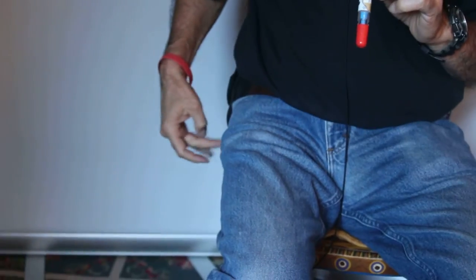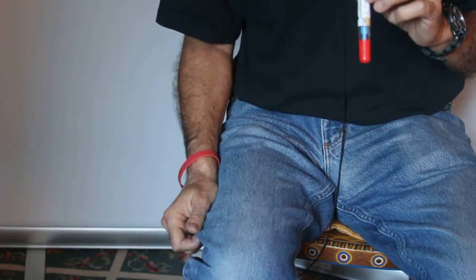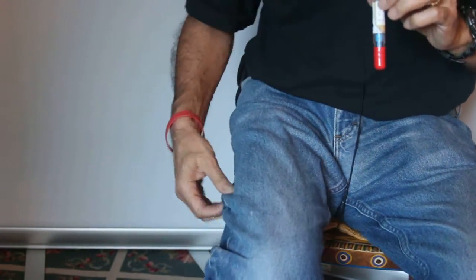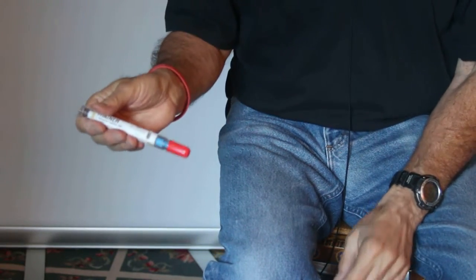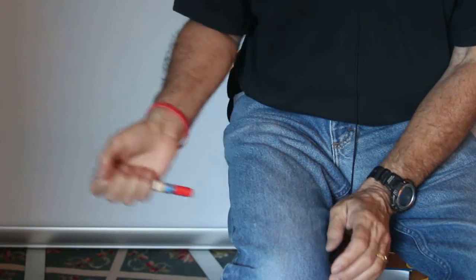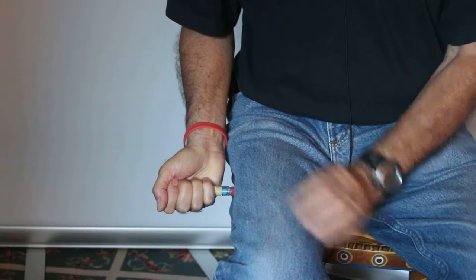This goes in the thigh, halfway between the knee and the hip. It can be injected seated, standing, through clothing, a dress, or bare skin. Try not to hit the seam of the clothing if you can. And it's not really like an injection — it's more like a stab. So you start out at the side and bring it in and inject it into the patient's thigh.